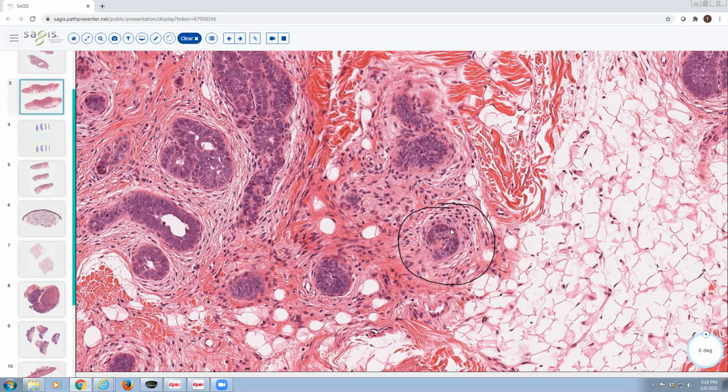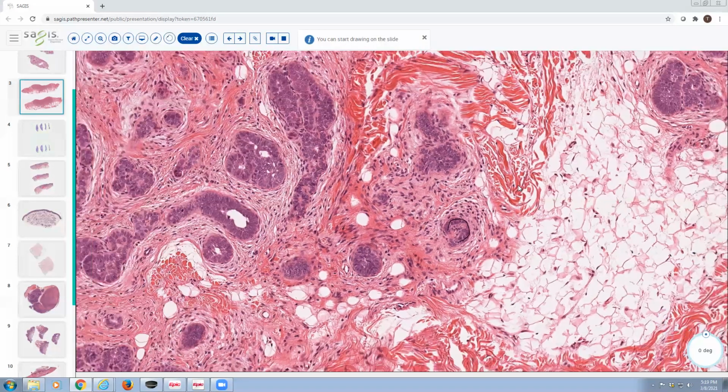And I always think of it as looking like a cup that's formed by epithelial cells. So you have this cup-shaped proliferation of epithelial cells. And then within that cup, you have a cluster of small, loosely organized mesenchymal cells. So it's sort of like a cup, and then you've got some grapes or some berries in that cup. What's inside the cup is loose and not organized very well. And then around it is this more organized epithelial proliferation. That is a papillary mesenchymal body.